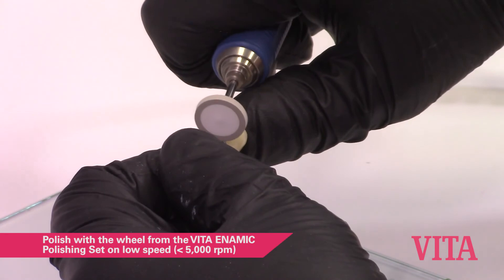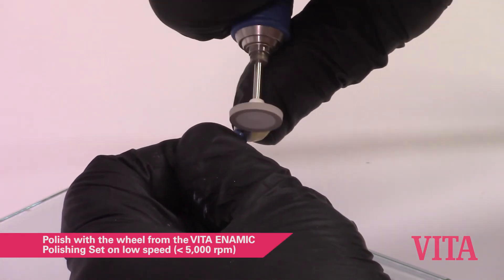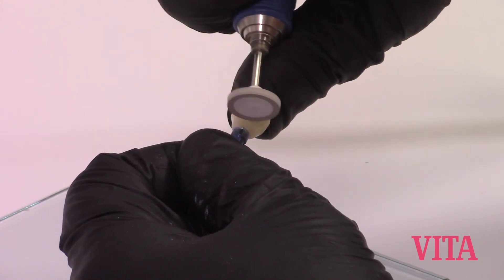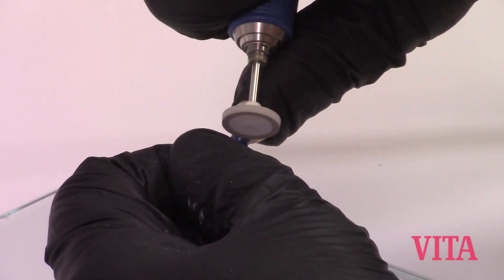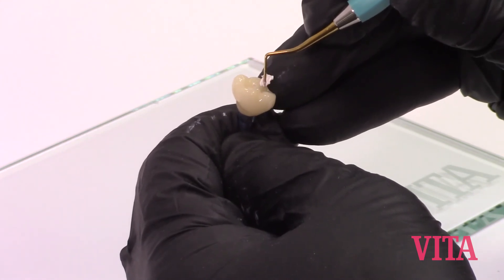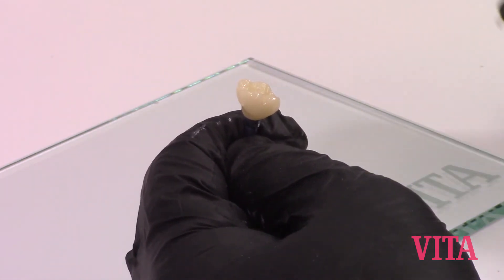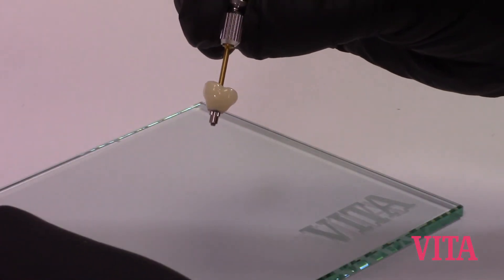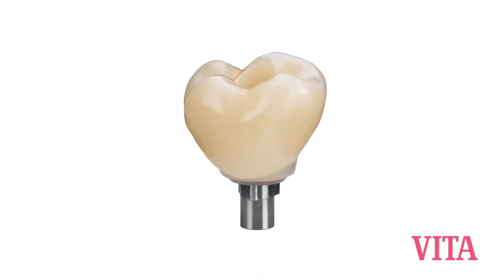Repolish the joint and the Enamic IS restoration to remove any excess adhesive and your marking lines. Remove your Teflon, then remove the restoration from the implant replica. After that's complete, you're finished.